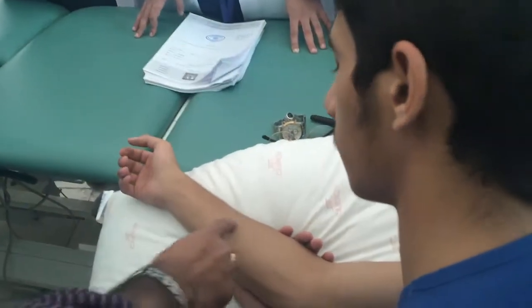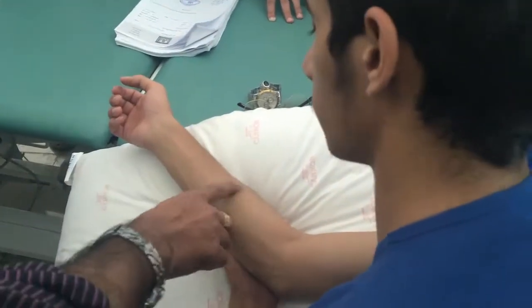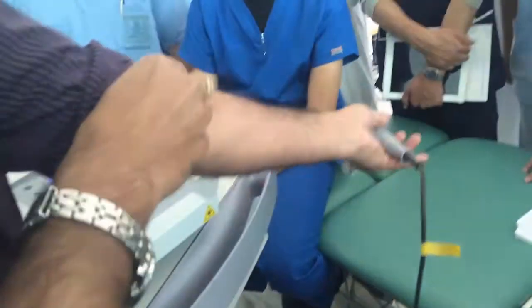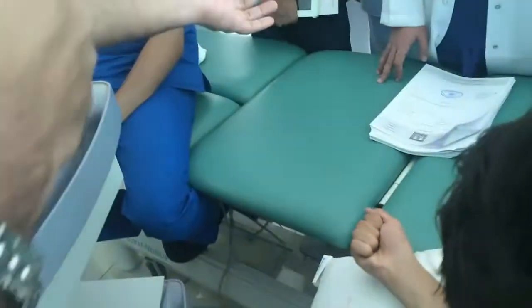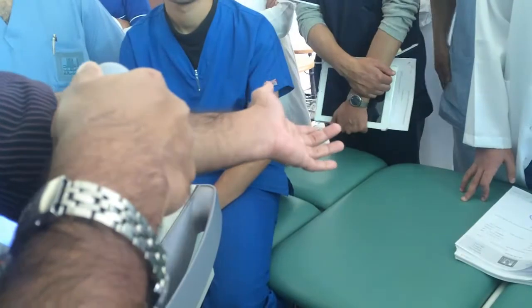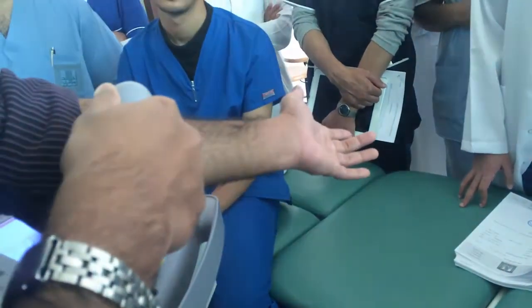If the area of the pain is large, we have to use the grid technique. If someone is coming with pain in only one area, one point, I use point application. I'll just put it here, that's it, for 1 minute or 2 minutes according to that. Is it clear what I'm talking?